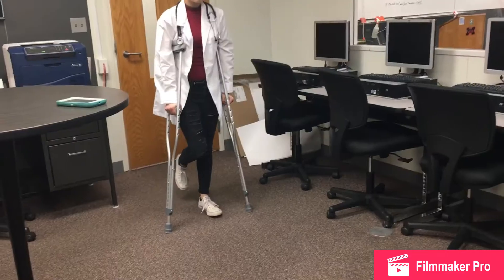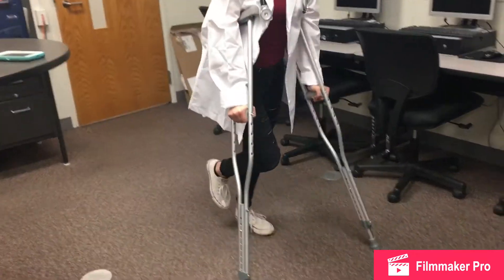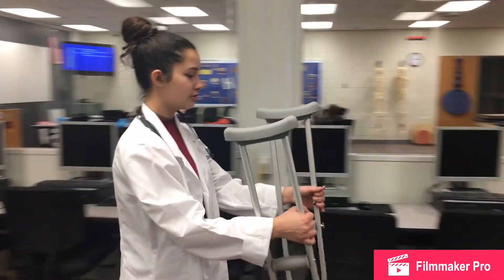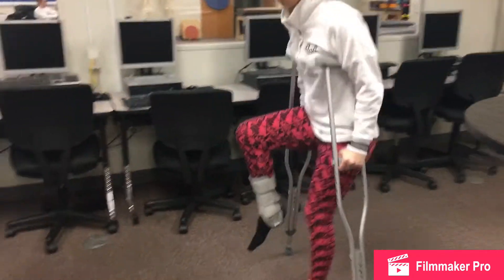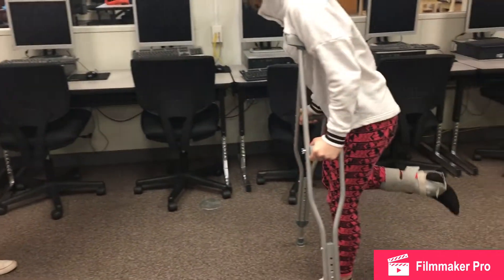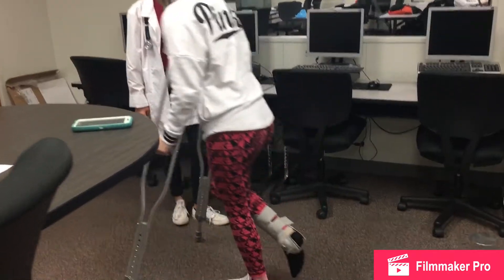I'm going to demonstrate how to do the three-point method. First, you want the crutch to strike the floor, and then your foot. Crutch, foot, crutch, foot. Now you try. It would be easier for you to keep the injured leg flexed at a 90-degree angle. There you go. It looks like you've got the form down.